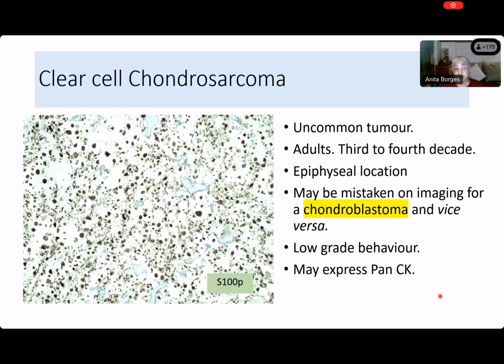Non-aggressive does not always mean benign. Here is a tumor that looks non-aggressive, yet it is a sarcoma. But because it is growing so slowly, see, low-grade behavior. It is like, you probably learned in your second MBBS. I hope you don't believe it when you came to post-graduation in pathology. What was the distinction between benign and malignant tumors? We used to write benign and malignant, and then we had a left-hand side, we had some rows, right? So what were the different features between benign and malignant as far as the growth was concerned?